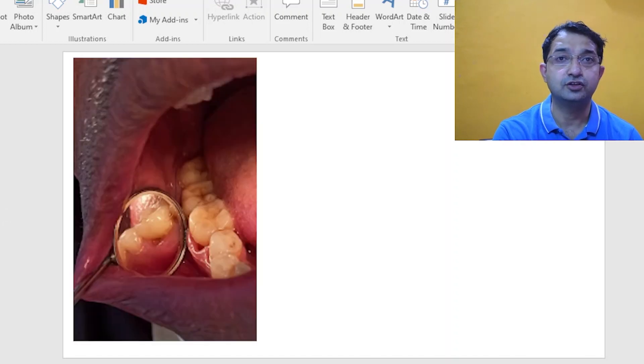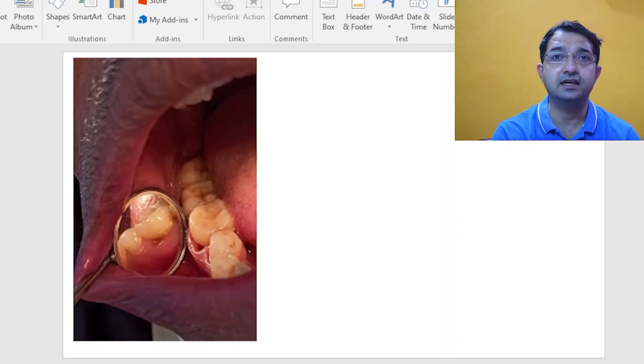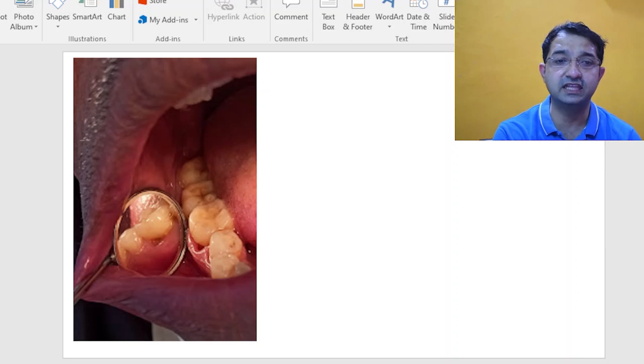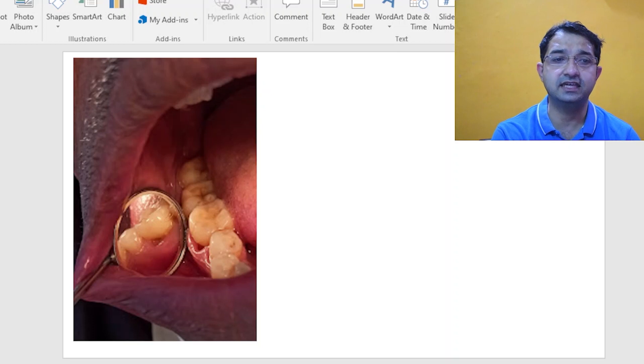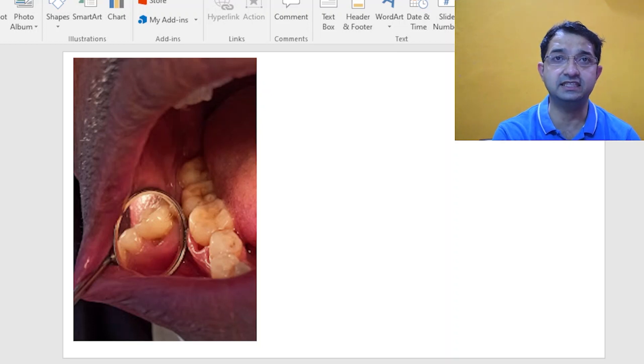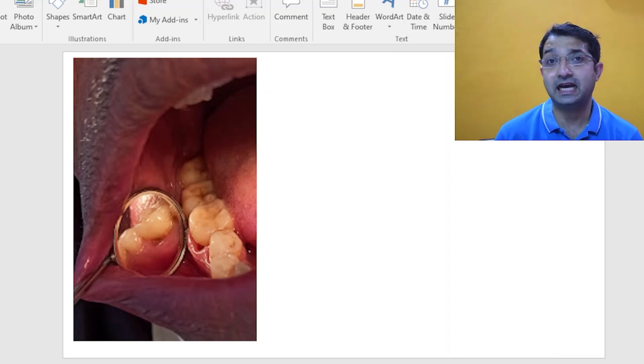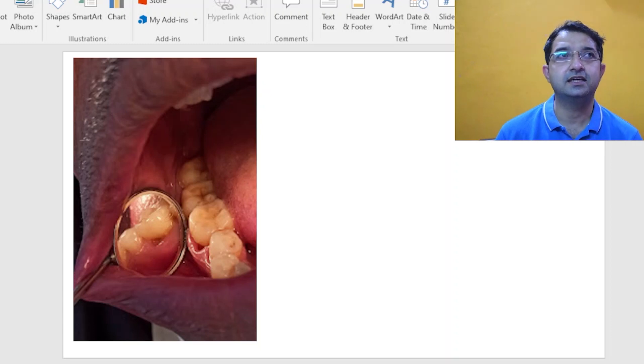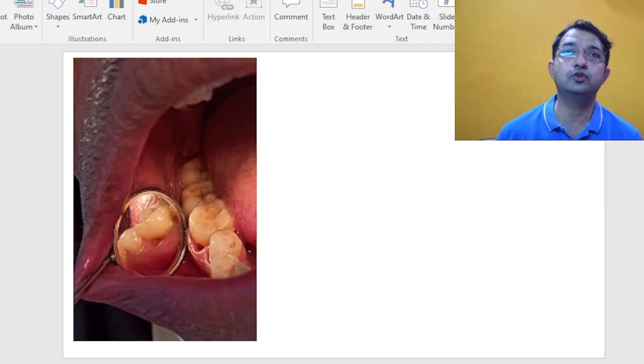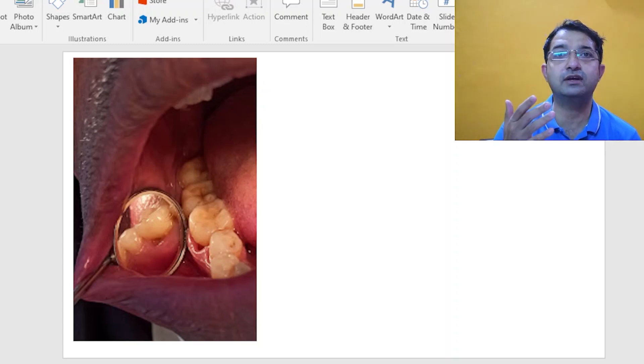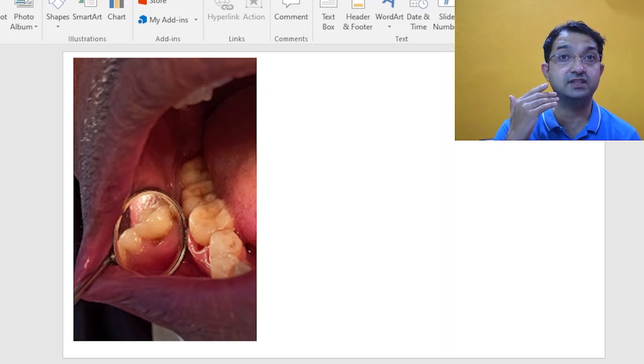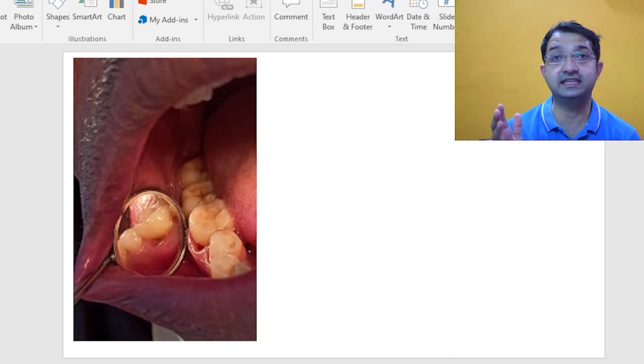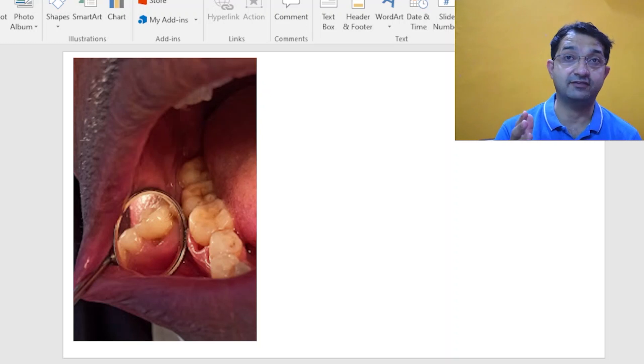Next is the picture again which we took, and if you see closely there is a class 5 lesion. Now the class 5 lesion is sometimes very tricky to diagnose because you really don't know the buccolingual extension of this class 5 lesion which happens in the cervical area of the tooth.